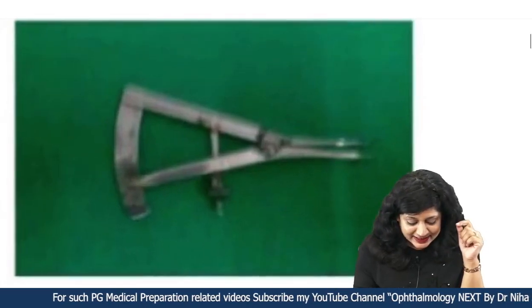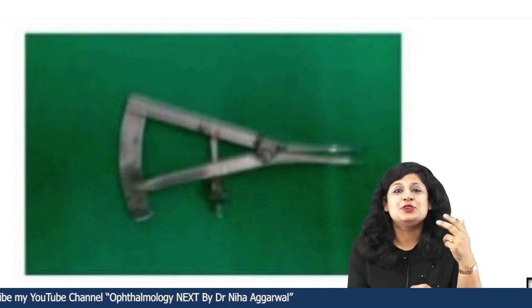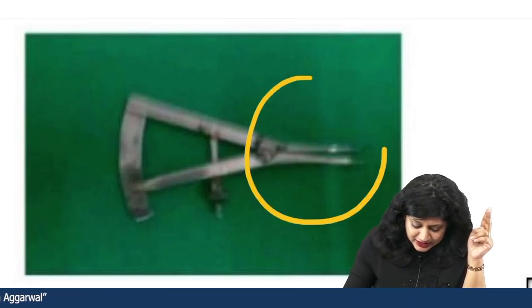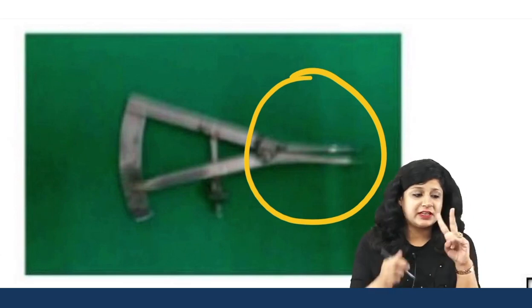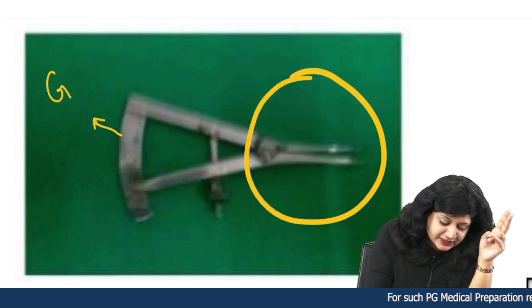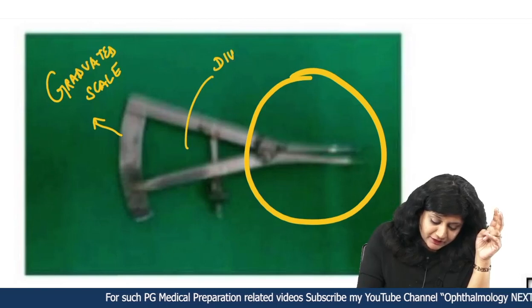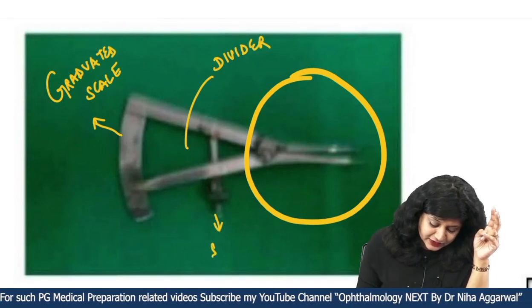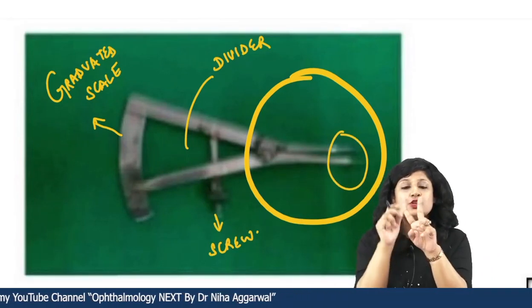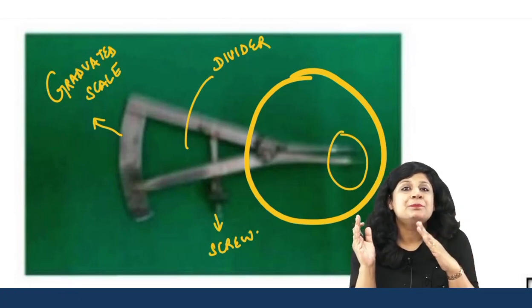If you look at this instrument, I am pretty sure it will remind you of your school days when we used to use the compass. It is a similar kind of instrument — just like a compass along with a divider, and above all it has this graduated scale that gives you the measurements. This is your divider along with a fixing screw, and here is the compass which will be opening. These two things help you in fixing the marks between which you will actually be taking the measurements.